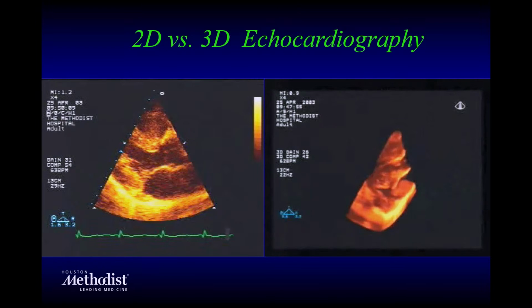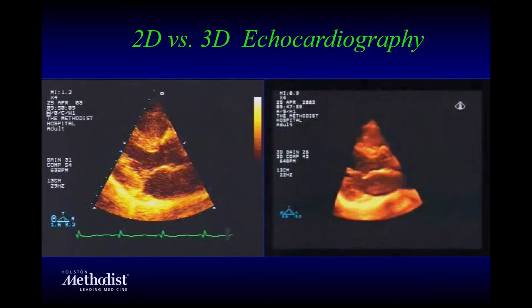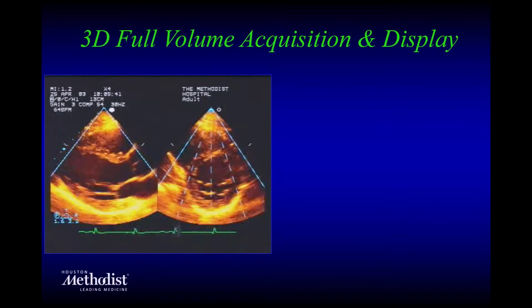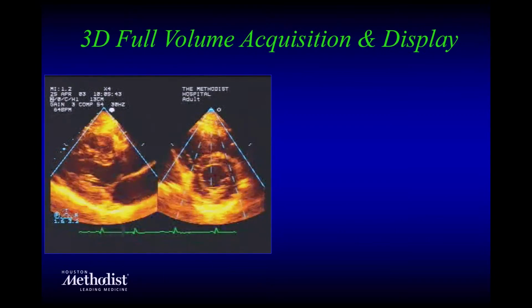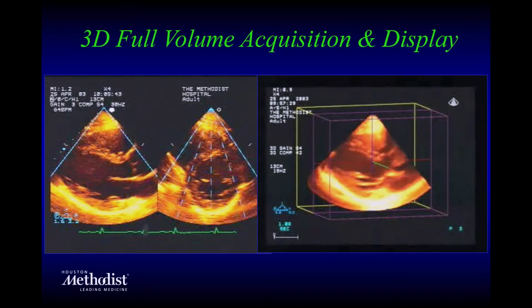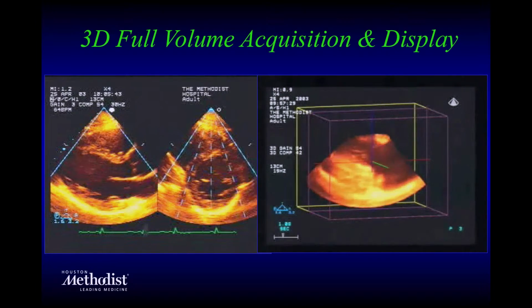We're not going to identify this individual, but it's great to be able to see that and the applications of 3D, either real time or basically a 3D total volume of this heart for you to be able to bisect it in different ways and, hopefully, have better assessment of ventricular volumes and overall ejection fraction, which I think would be very important, particularly when you have somebody with different regional wall motion abnormalities.